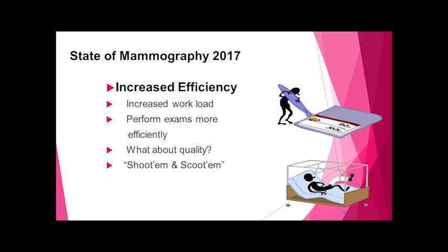So we focused on increasing efficiency, and now we're looking at the quality. And certainly there's nobody that gets up on any given day and says, I think I'll do some bad procedures today. I think I'll interpret them incorrectly. We're all trying to march to the same beat of the same drummer, but we're setting a stage where it's difficult. And so we're going to look at how we can overcome some of those difficulties and truly focus on the overall quality of the procedure.